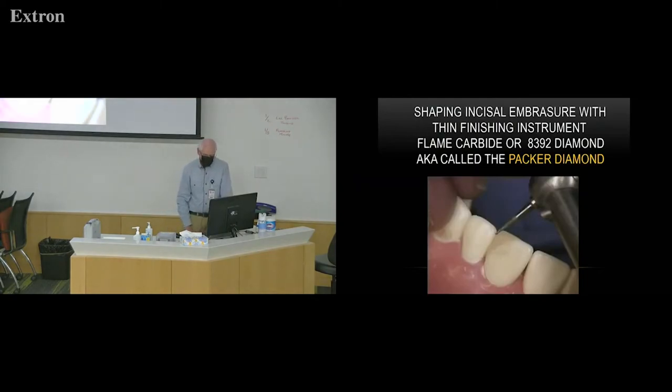Now this is called a Packer diamond. You know Dr. Packer? Have you guys met him yet? Okay, he teaches some nutrition courses for us. And we have these in the dispensary. I'm not sure that you have it on your burr block. So when it comes time for finishing, just go ask. I'll ask her to pass them out today.